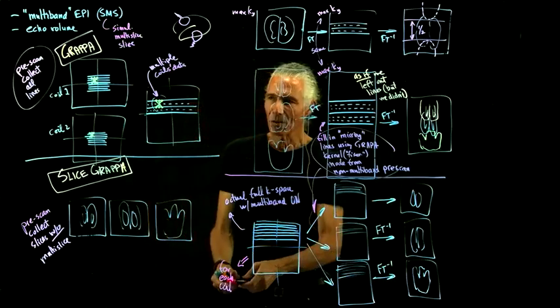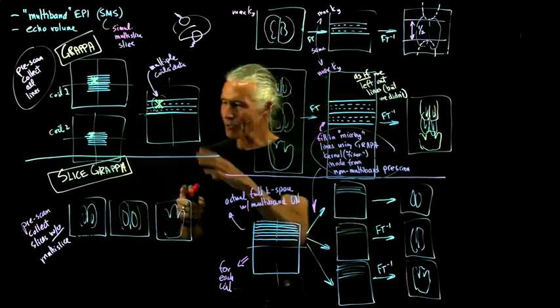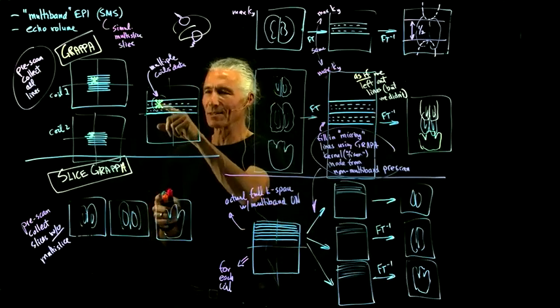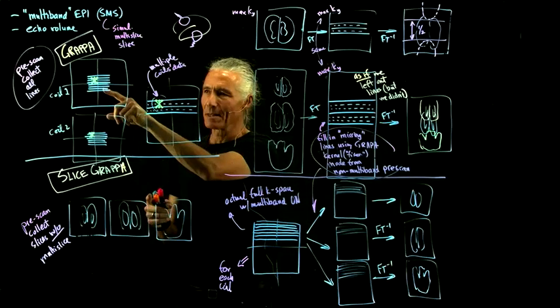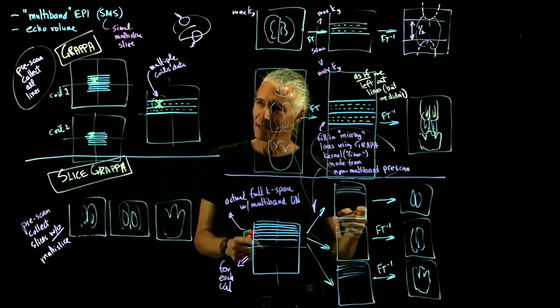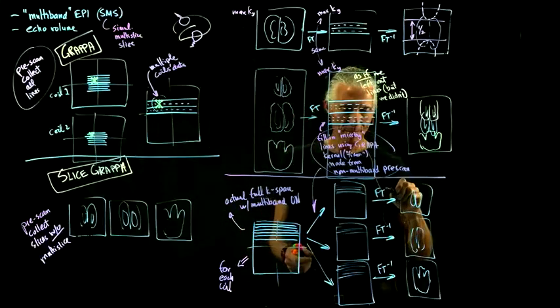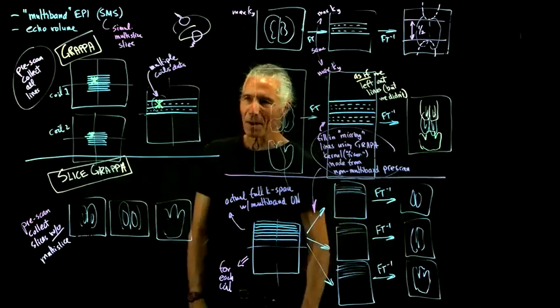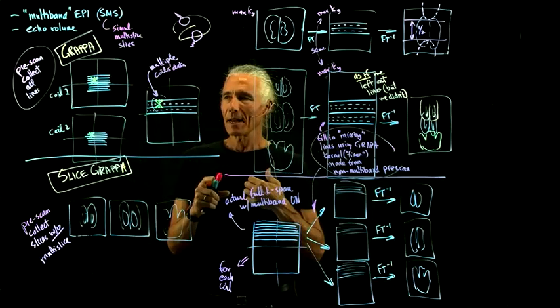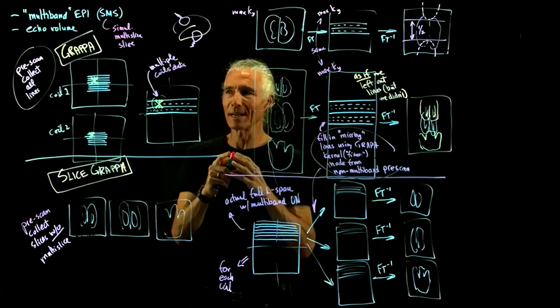So you take that data for each coil, and then you fill it in by doing this thing that's sort of like GRAPPA, but not quite, though it's the same procedure, where you make a little fixer based on the full data, and then you use that fixer to fill in the missing lines of K-space, because you're tripling the lines of K-space here. Then you inverse Fourier transform it and get your non-overlapping slices. So basically virtually all functional MRI is done this way, and I would wager that 99.9% of the people who are doing it don't understand how it works.